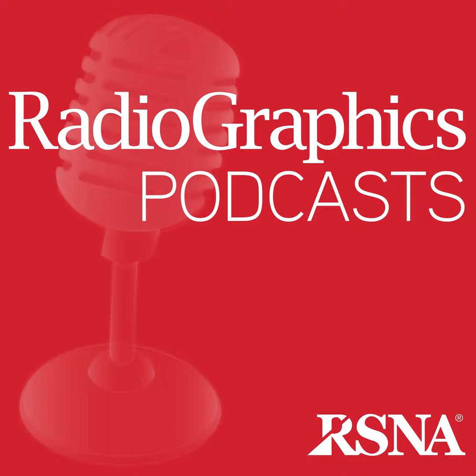Hi, my name is Elliott Kirk Gozansky from New York University Langone Health and Grossman School of Medicine. Welcome to the RSNA RadioGraphics podcast. I will be talking about chest CT angiography for acute aortic pathologic conditions, pearls and pitfalls, by Jane Coe, Jonathan Goldstein, Larry Latson, Leah Azor, myself, Elliott Gozansky, William Moore, Smita Patel, and Barry Hutchinson.